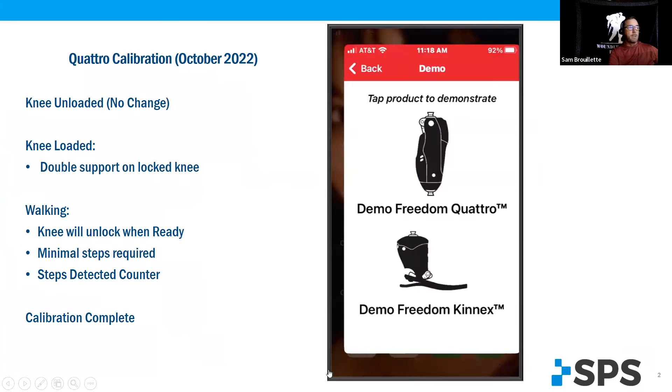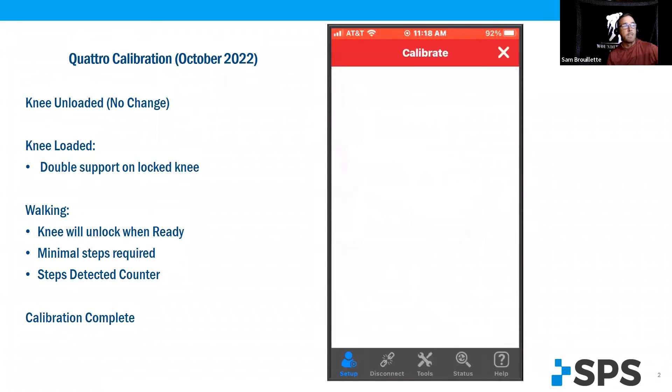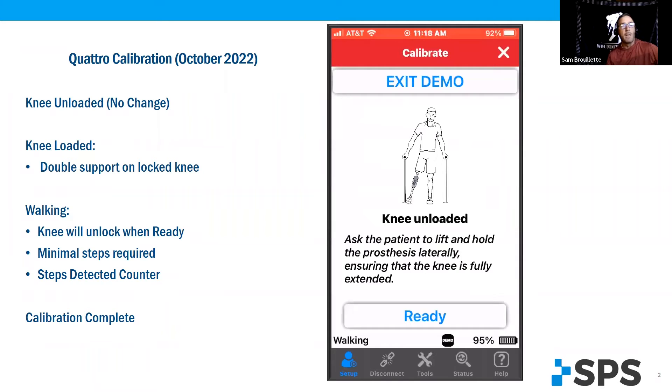So on the calibration, this is quick. We're going to work with my demo recording. We'll select calibration or full setup. Knee unloaded has not changed — lifting the knee off the floor laterally, fully extended, hit ready.